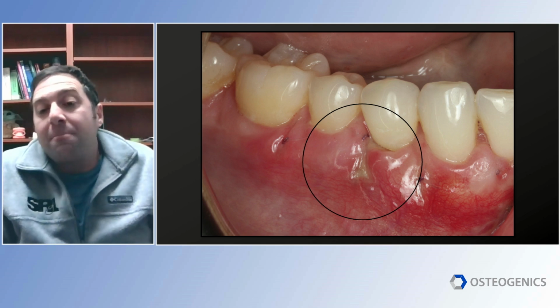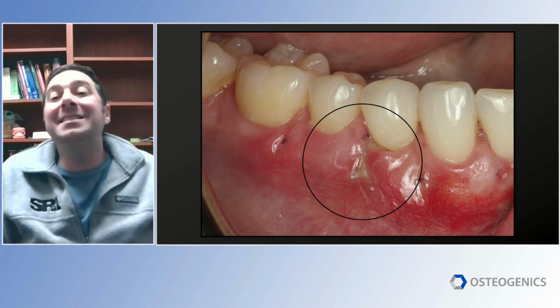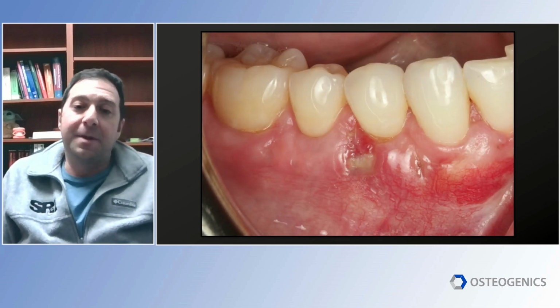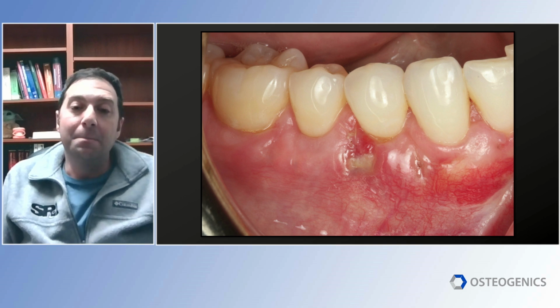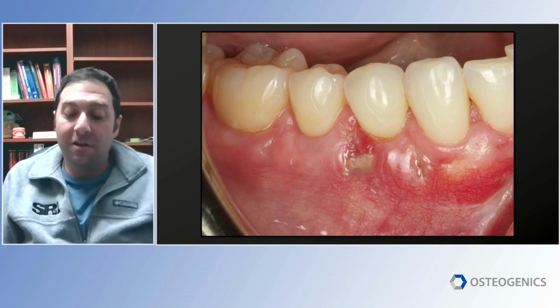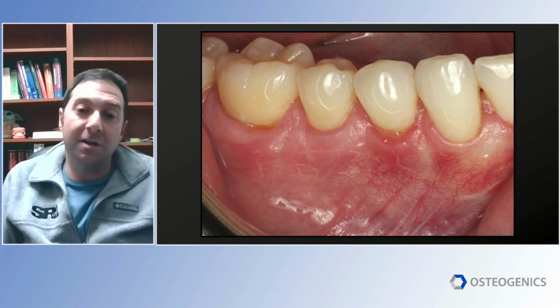But this was microderm, and I'd had lots of good success with it otherwise. I wanted to see what happens if you do nothing. So I said, okay, you're healing great, I'm going to see you in another 2 weeks. The patient came back at 4 weeks, and lo and behold, we can still see a little bit of that microderm, but it's granulating in. It's not causing any more problems. It's not getting infected. So here's 4 weeks, and here's 8 weeks, complete resolution.